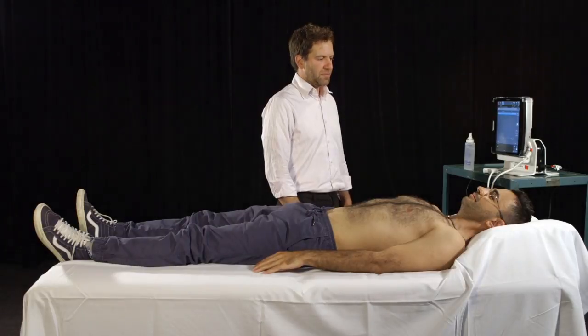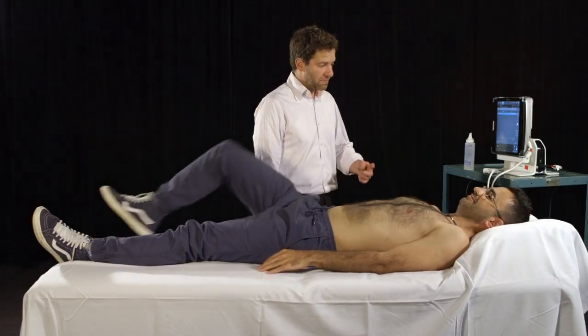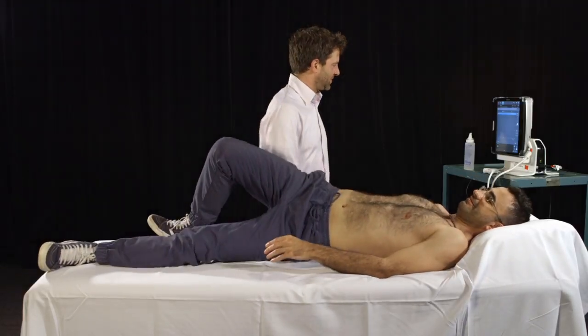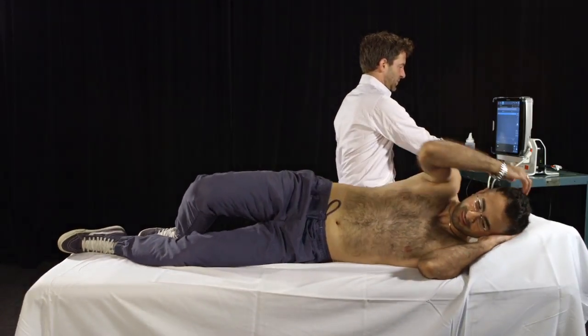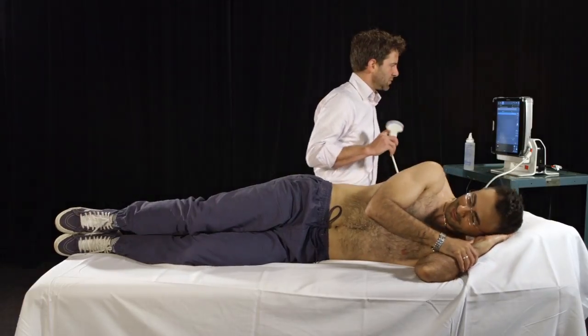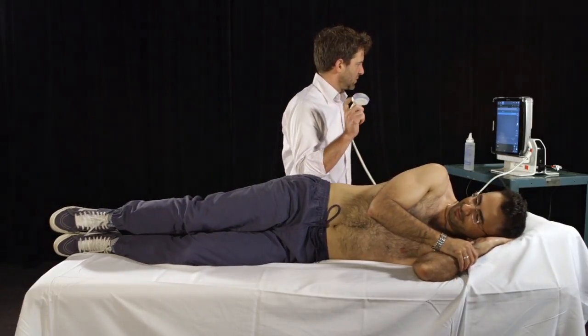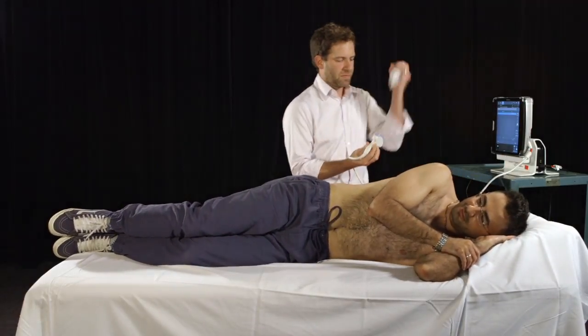Patients are generally in a supine position for most point-of-care scans, including the gallbladder exam. However, if your patient can cooperate, you can help optimize the gallbladder visualization by asking them to lie on their left side.